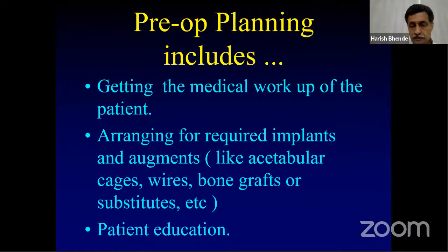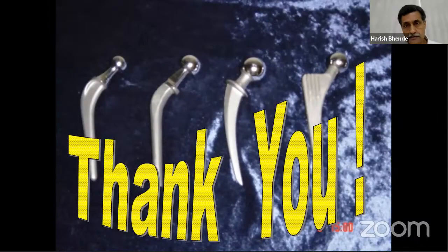And you have to educate the patient about how to sit, how to talk, etc. So basically, templating is not the end of pre-op planning. It needs a lot of things, but templating is an important part. And if you do it well, you can get a lot of information which can prevent the risk and complication of your surgery. Thank you.